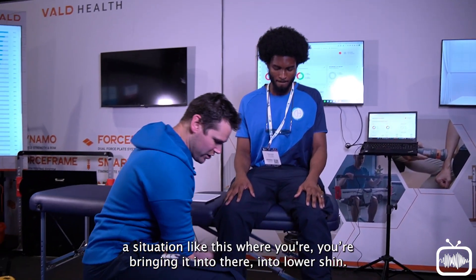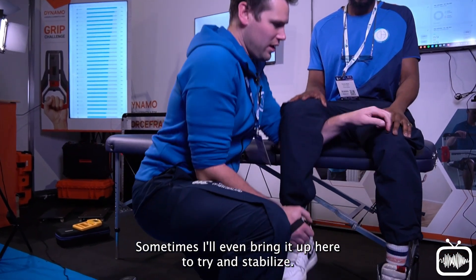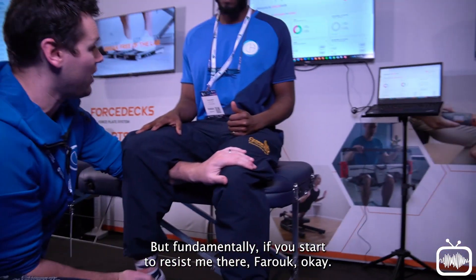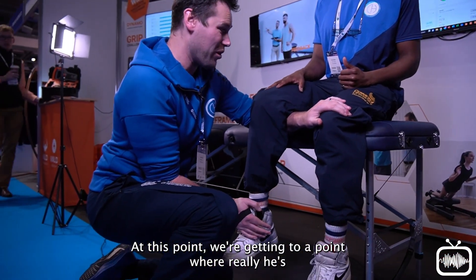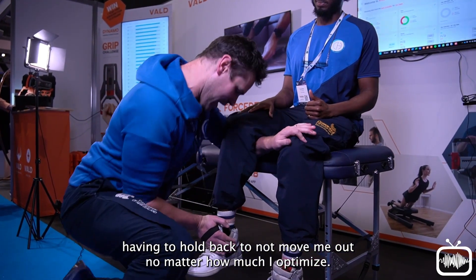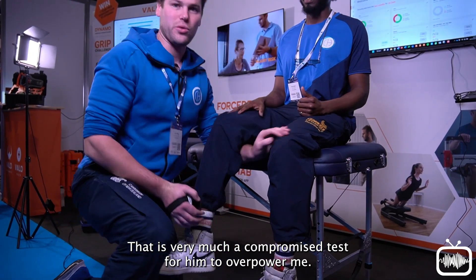You end up clinically in a situation where you're bringing it into the lower shin, sometimes bringing it up higher to try and stabilize, but fundamentally if the patient starts to resist you, at this point we're getting to a point where he's having to hold back to not move me out. No matter how much I optimize, that is very much a compromised test for him to overpower me.